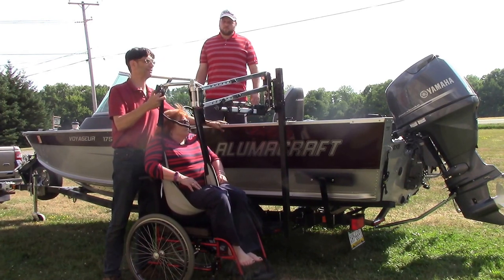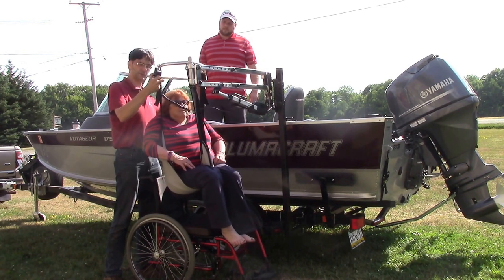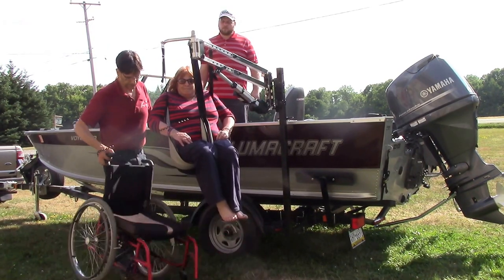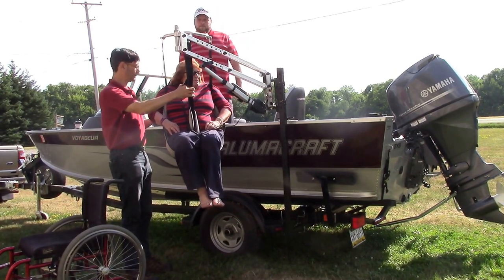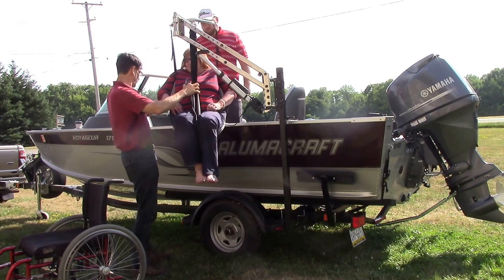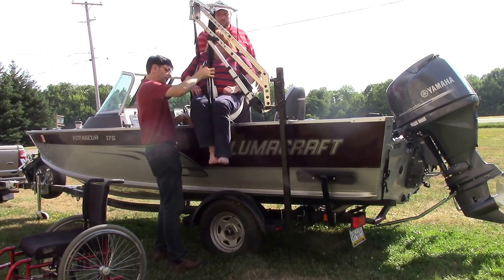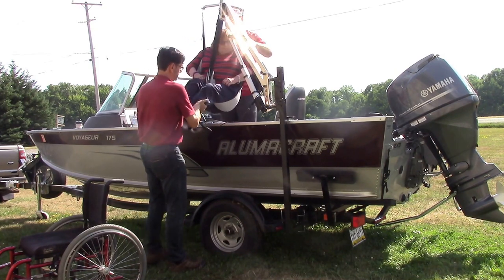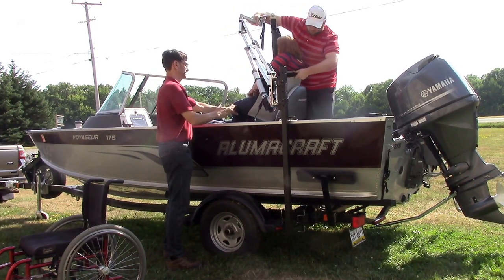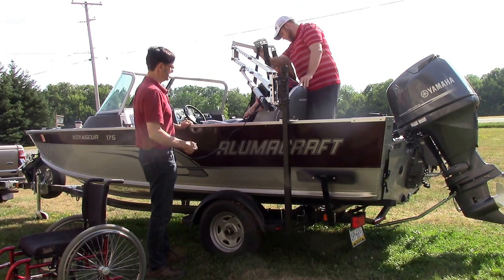Now if you like you can actually just set the person right on the side. If you're a one-person operation, set them on the side, climb up into the boat — or of course if you're on a dock you just walk right into the boat. Once I'm all the way up, I'm going to get the wheelchair out of the way and we're going to go on to the boat facing outward. You don't have to wait until the legs have cleared; you can go when you just got the bottom cleared. Now that I've cleared the side of the hull, simply lift the legs. And we're in.